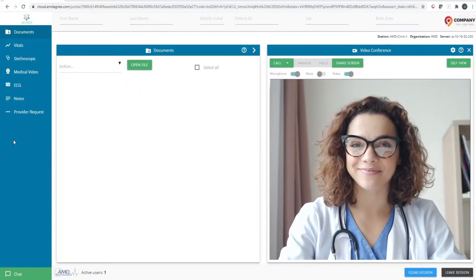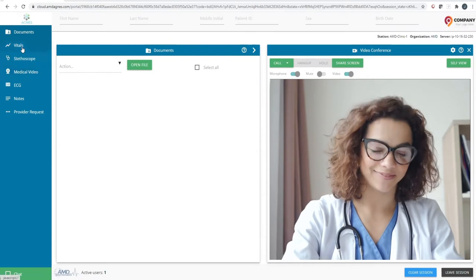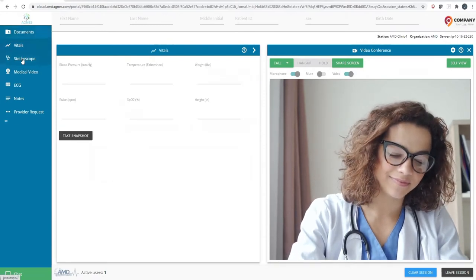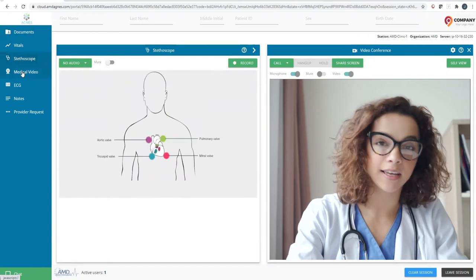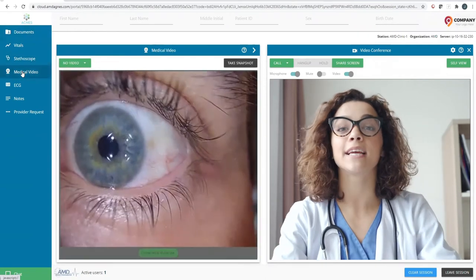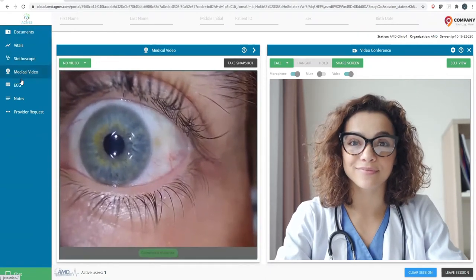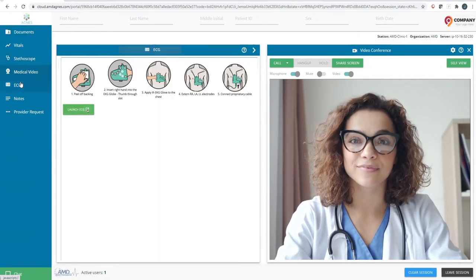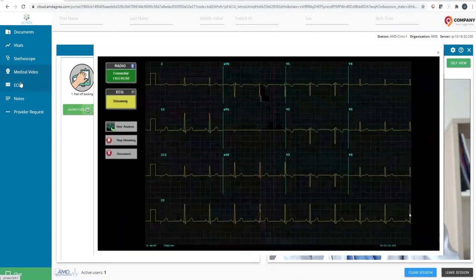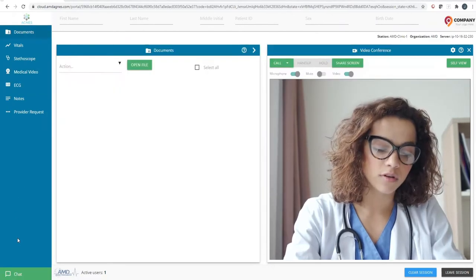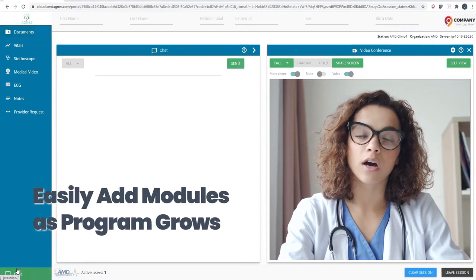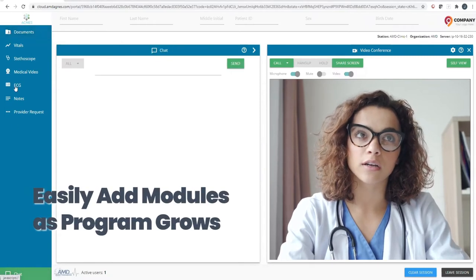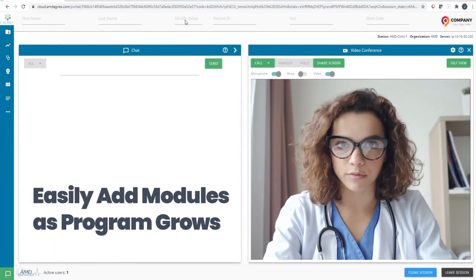As you can see, Agnes Connect is designed with multiple modules shown on the left-hand side. Each of these represents various steps in a clinical patient encounter. This allows our customers to purchase only the modules they need initially, but then easily add on as their program grows and their clinical needs expand.